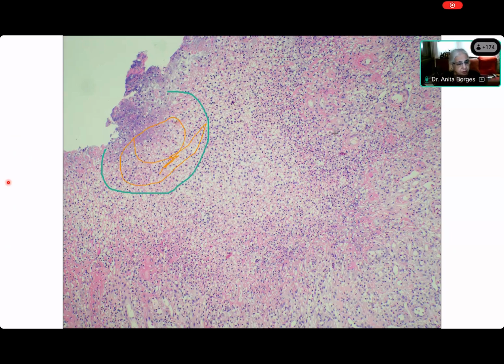One minute. You are calling this the base of the ulcer. Elsa, is this the base of the ulcer? Sorry, ma'am. This one is the base of ulcer. Which is the base of the ulcer? This one. Oh, here now. You've drawn something here. This is the base of the ulcer, and this is the surface of the ulcer. Elsa, do you think that either of these is the base of the ulcer? No, ma'am. So now you ask for annotation.